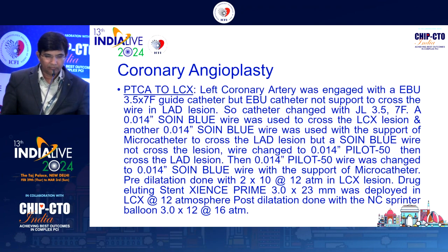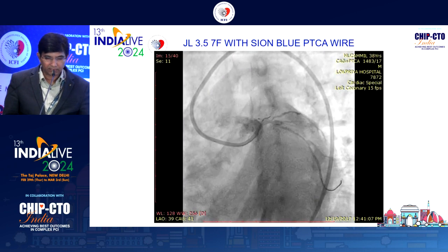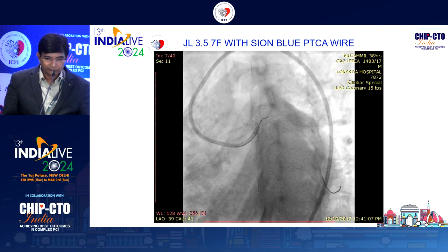So after getting the high risk consent, the patient was shifted to CCU for 1 day, and with the family consent, in the morning it was taken for angioplasty.